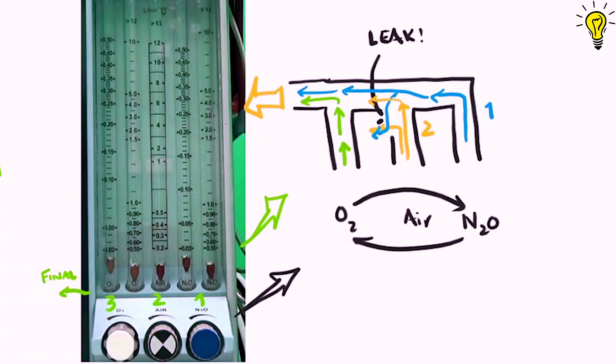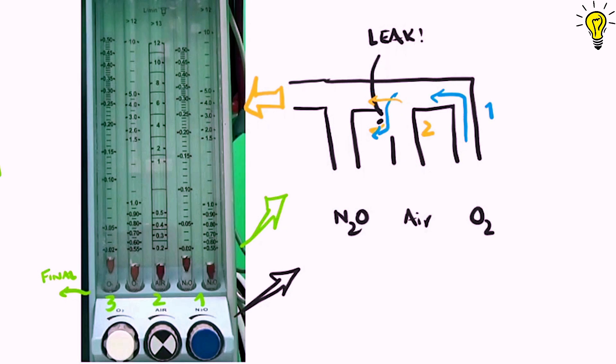Now let's just interchange the nitrous and oxygen positions to get the concept of this. If nitrous is placed downstream, it will go out into the final mixture as intended. But oxygen will be wasted through the leak or breakage now. So the final mixture will be hypoxic and deadly for the patient.